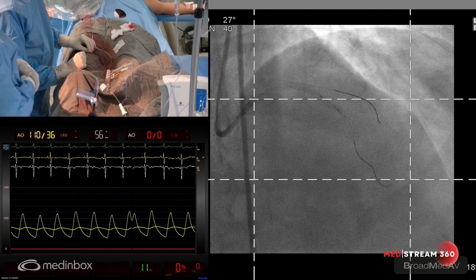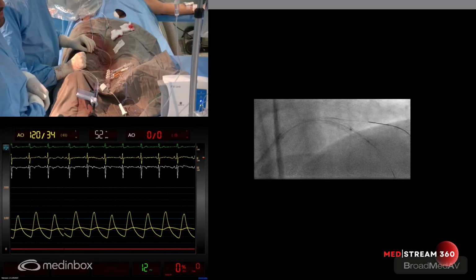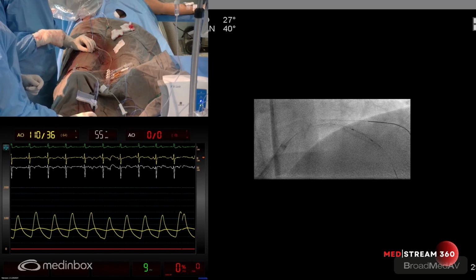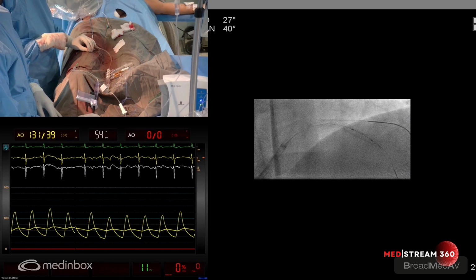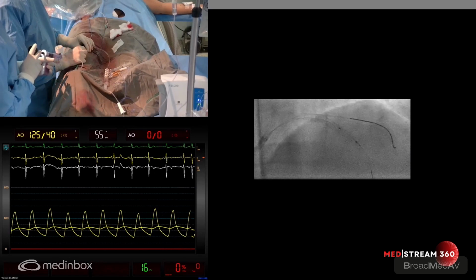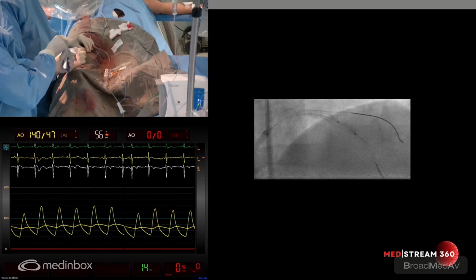Ready? All right, so we can fluoro and then take a decision. We need to go a little more. A little bit in, yeah. Can we go off the freeze film? Fluoro. All right, we can go just distally. Go in a bit. Go up there. Yeah, it's okay. I'm pulling it back. Yeah, go ahead.